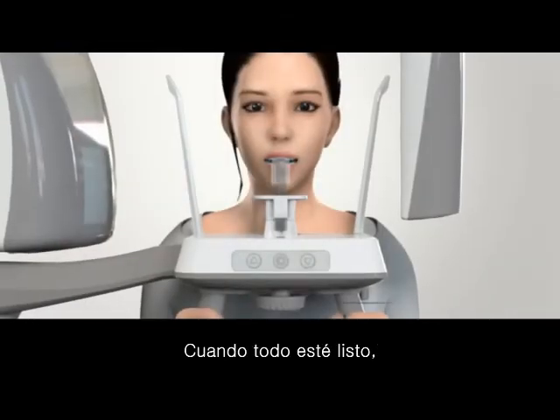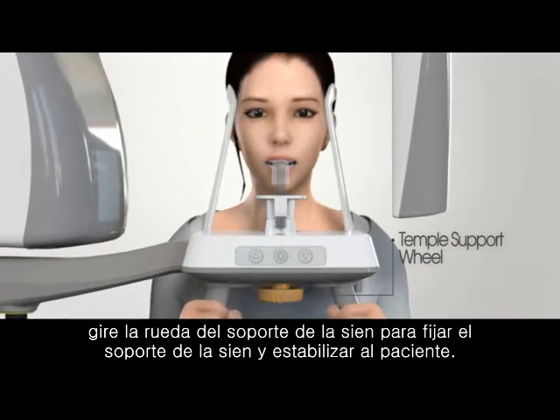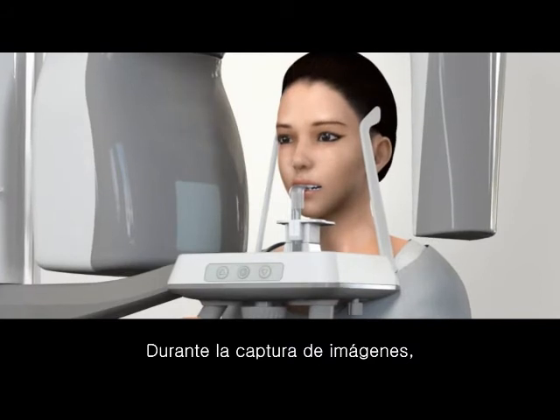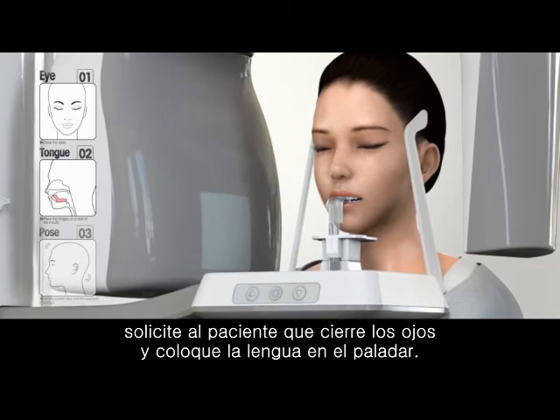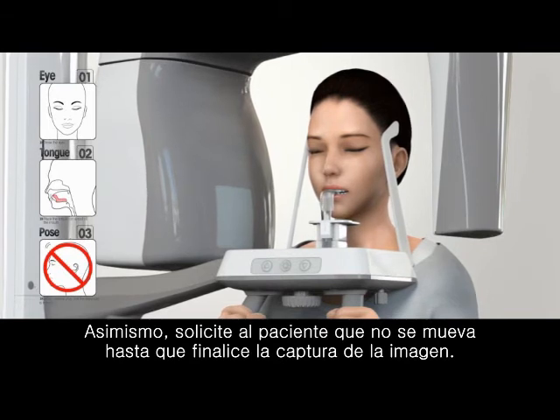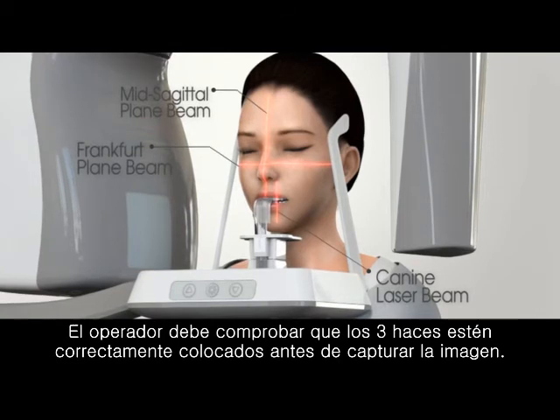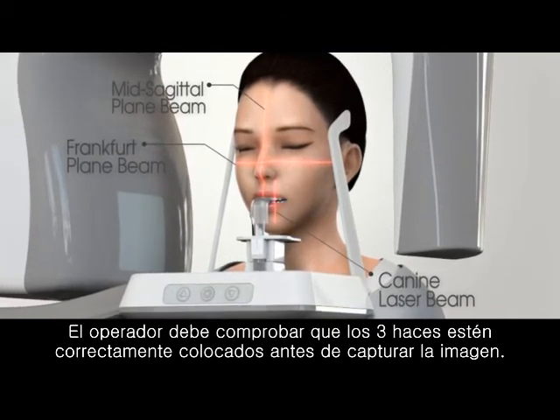When everything is ready, rotate the temple support wheel to tighten the temple support to stabilize the patient. During image capturing, ask the patient to close the eyes and place the tongue to the hard palate. Also, instruct the patient not to move until the image capturing is completed. The operator should confirm 3 beams are placed appropriately before capturing the image.